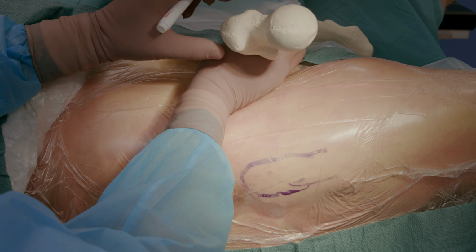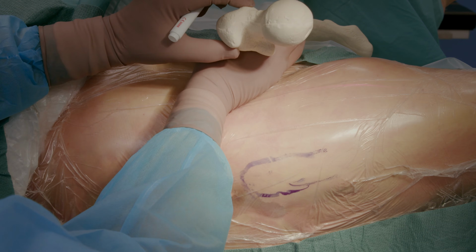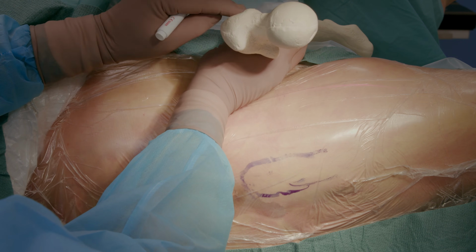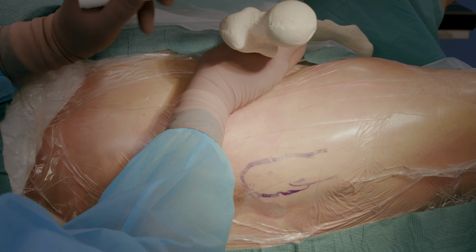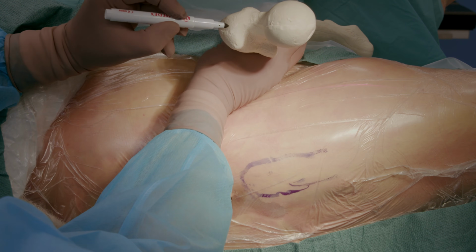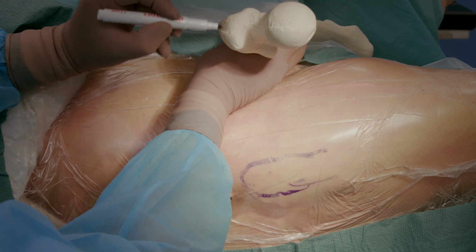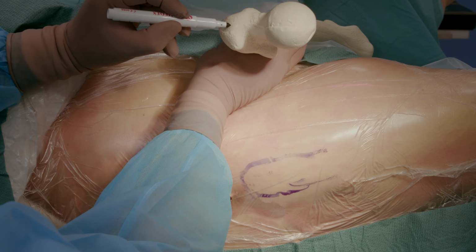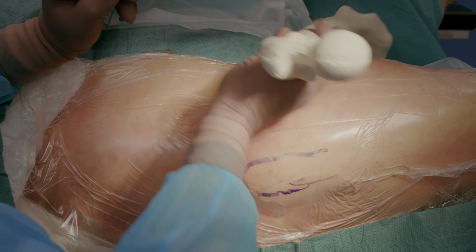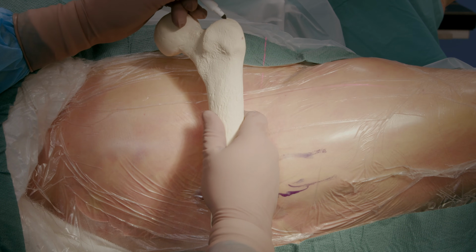This model of the left femur will help to demonstrate the nail insertion site. Higher up is the anterior side, and here is the posterior side of the femur model. The nail is inserted via the tip of the greater trochanter. We can divide this distance into 3 parts. In this view, we see the upper third and the middle third, and we aim at the junction of the anterior and middle thirds. And in the AP view, the nail insertion site is here at the tip of the greater trochanter.